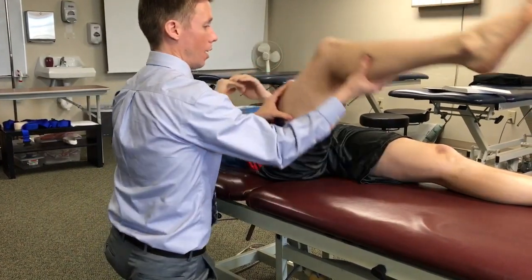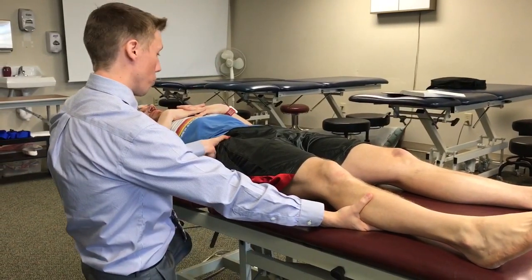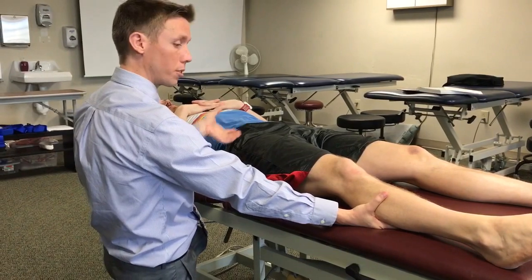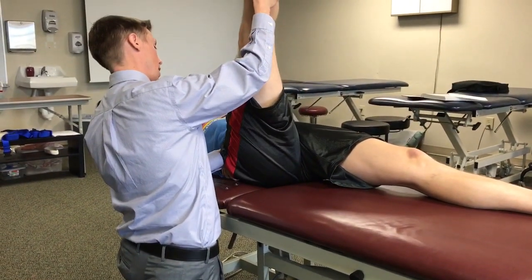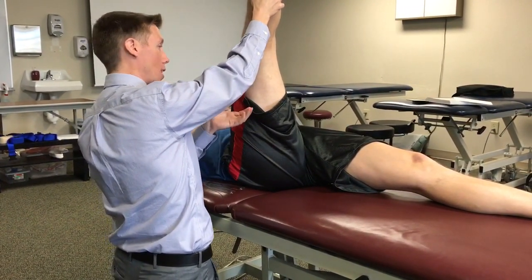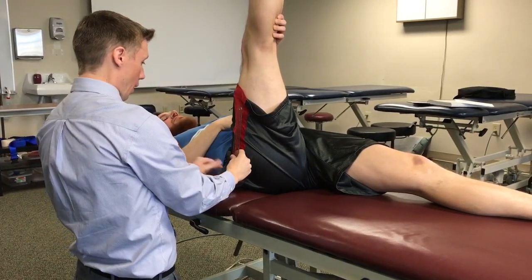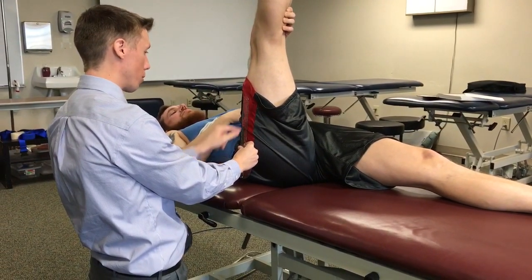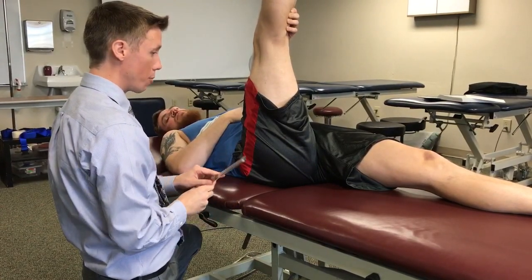We can also do hip flexion with the knee straight, which measures hamstring flexibility. Again it's important to palpate the innominate to see when the pelvis posteriorly rotates — that's when we stop the measurement. So we take him up this way, and here I feel his pelvis start to posteriorly rotate, so I stop. We take a similar measurement using the greater trochanter as the fulcrum, lateral epicondyle of the femur as the movable arm's landmark, and stationary arm parallel to the midline of the body.